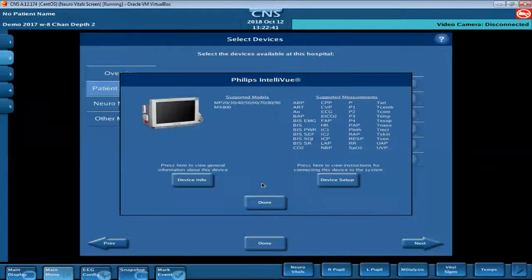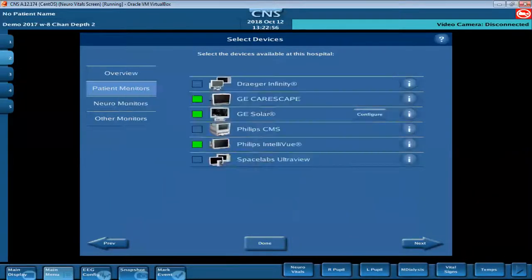So we've gone back and said, hey, the staff really have a need to look at some of these other labels. We know that they're in your monitor somewhere. Can you work your magic and make it so that they can access those? And they say, oh, sure. So that's another thing to consider, is just communicating with biomed.